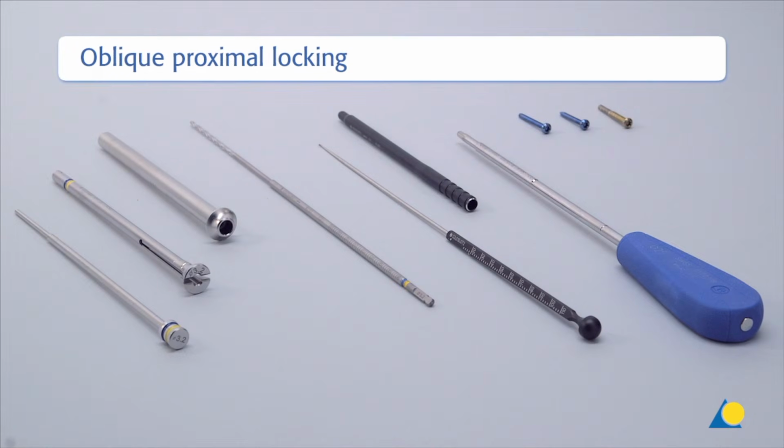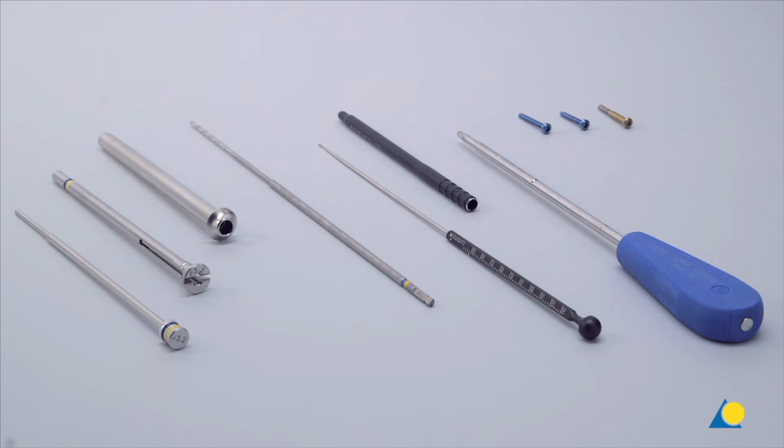The instruments used for oblique proximal locking are the same as those used for proximal locking. For oblique locking, a cancellous bone locking screw, star drive, 5.0 mm diameter with dual core, self-tapping, is also needed. This screw is coloured gold. The gold colour of the screw corresponds to the yellow markings on the three-part trocar combination and drill bit, as well as the aiming arm.